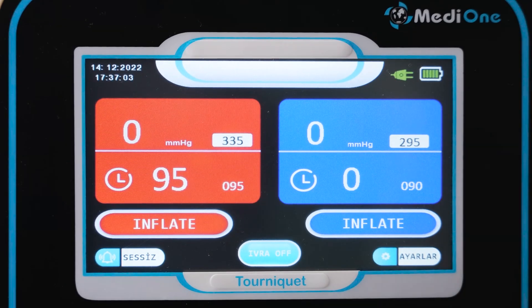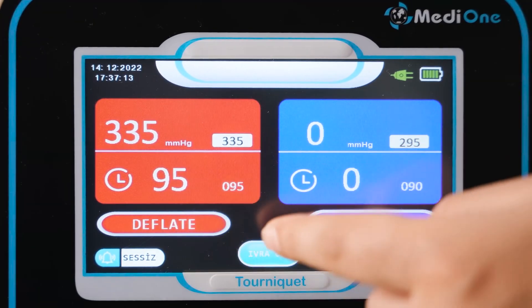Press the inflate icon once to inflate. Press the deflate icon twice to deflate, for security reasons.